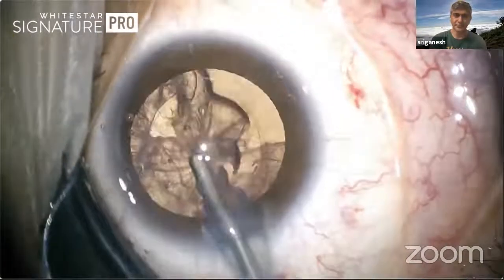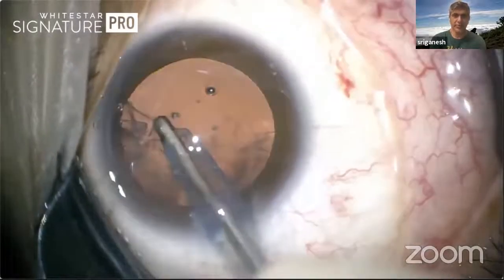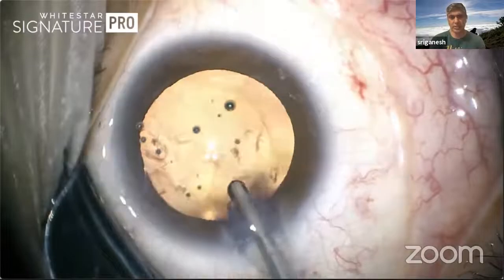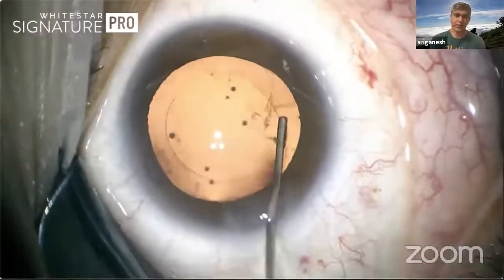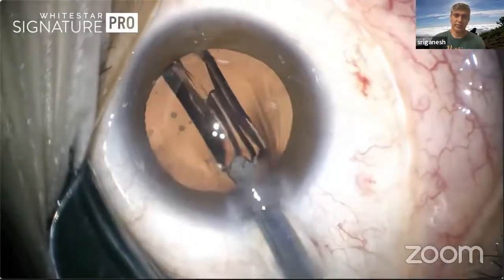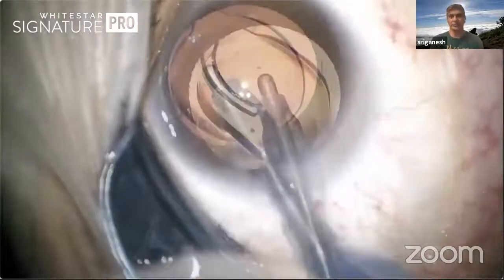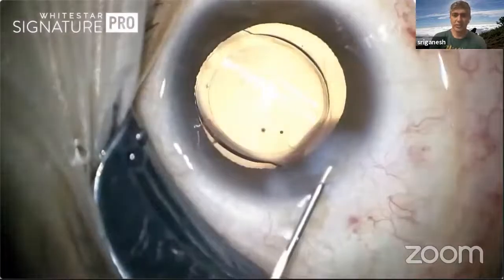And then, of course, here, again, some people may be concerned about the biometry. If you're using ultrasound, again, no need to make much of alteration, because there's not much of difference. So no need for any adjustments. And with an optical biometer, no adjustments at all. And here we are injecting a single piece IOL into the capsular bag. So managing these cataracts post ICL is quite easy if you know the technique, and the results are quite good.